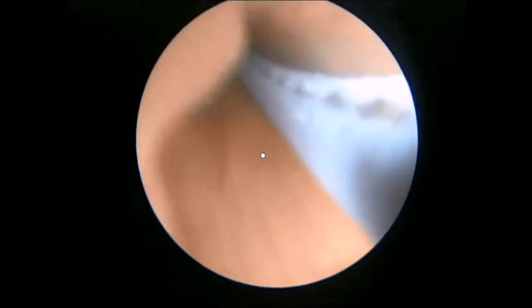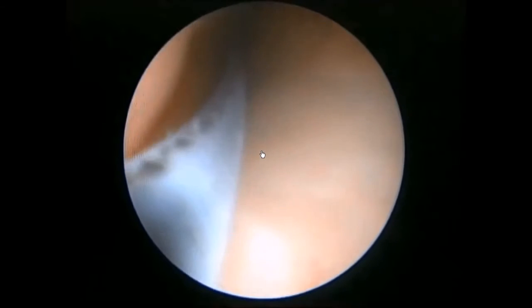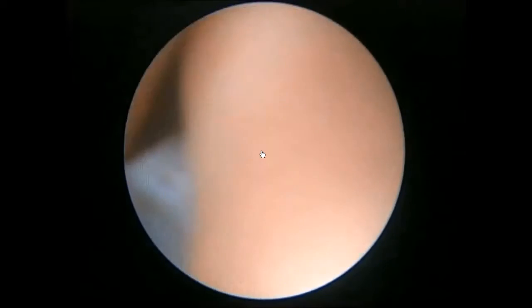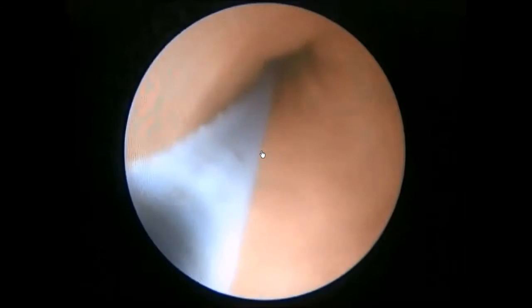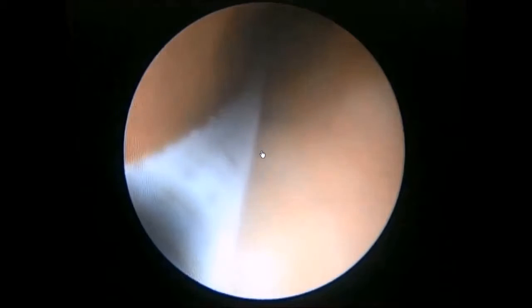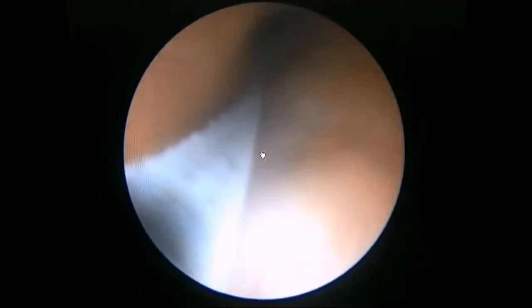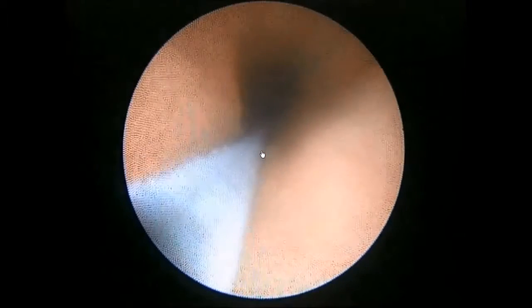We start with a semi-rigid ureteroscope. Here we pass through the ureter to the collecting system of the left kidney.